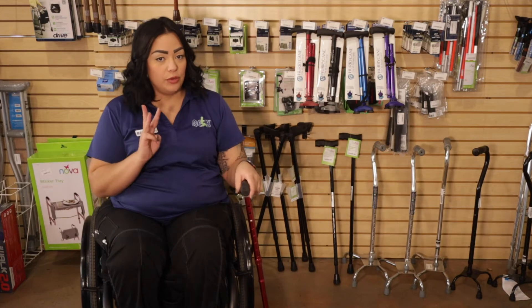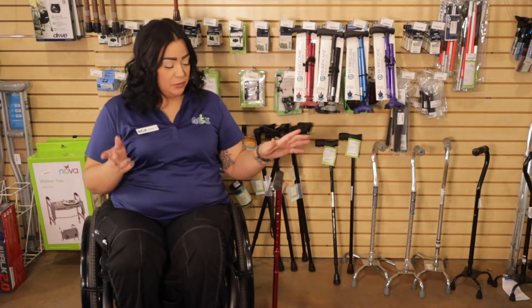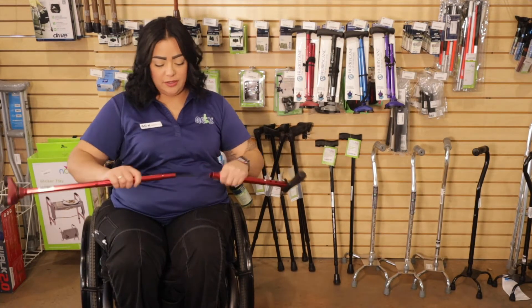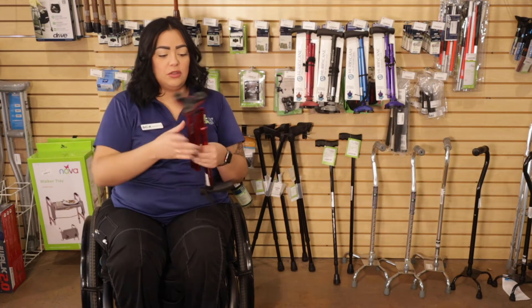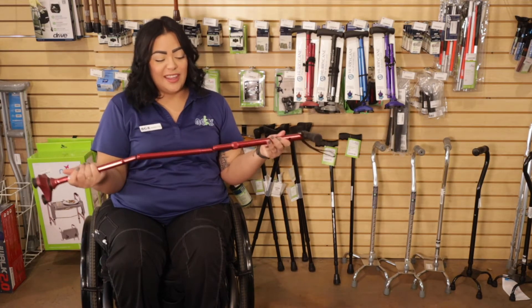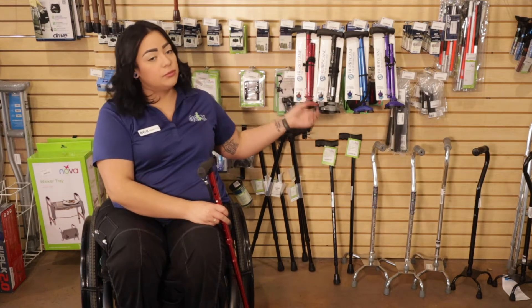We also have the three prong. This one's a little bit smaller. It stands by itself — pretty cool. And it also comes apart, so you're able to throw it in your purse if you're traveling or just simply going to the store. They also come in different colors: red, purple, blue, and black.